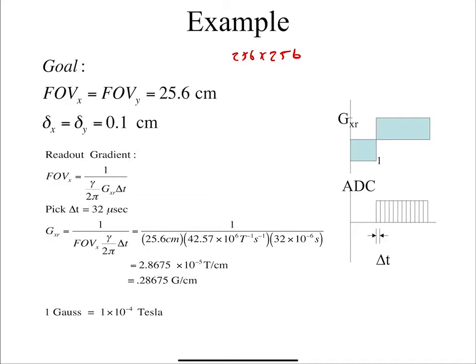So now you actually need all that data. Later on, we'll show you how, with things like deep learning and other new methods, you can get away with less. Everything I'm telling you now is classical image reconstruction. What we'll talk about probably in the last week is advanced image reconstruction, where you can actually go beyond these sampling requirements. But this is the fundamental, so it's good to know what they are. This is like the speed limit.